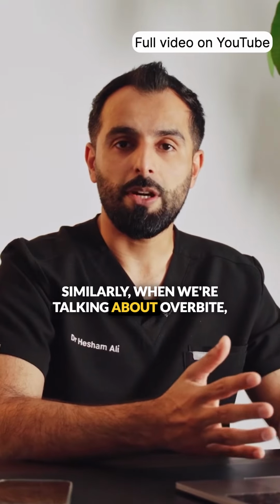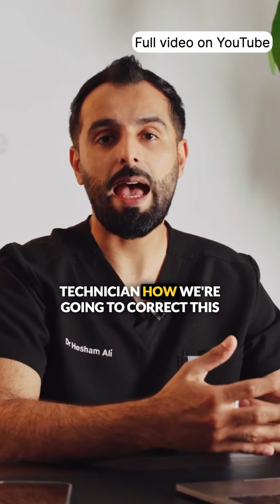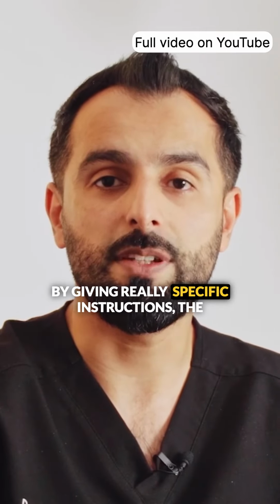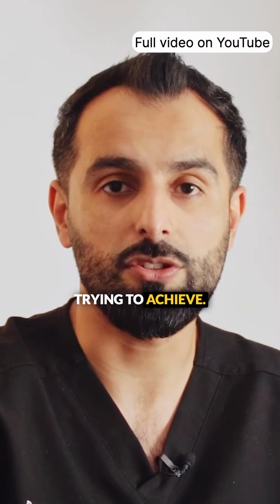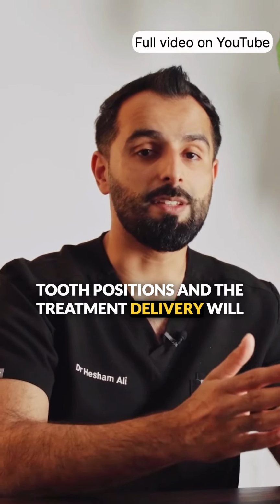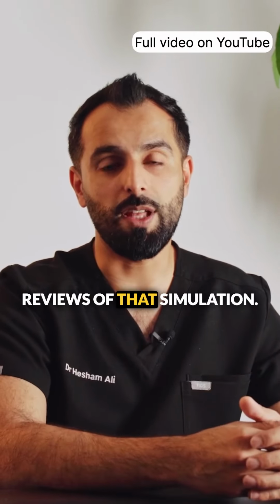Similarly, when we're talking about overbite, we need to try and identify for the technician how we're going to correct this vertical relationship. By giving really specific instructions, the technician will know exactly what you're trying to achieve. Right now, we're just looking to finalize the tooth positions, and the treatment delivery will be considered in more detail in subsequent reviews of that simulation.